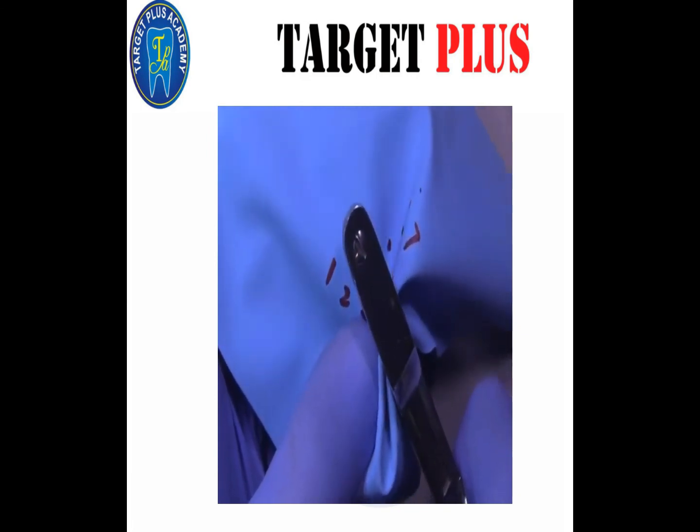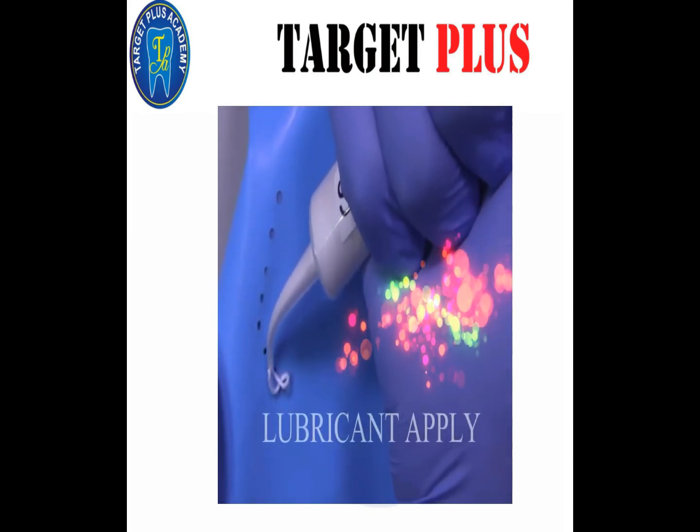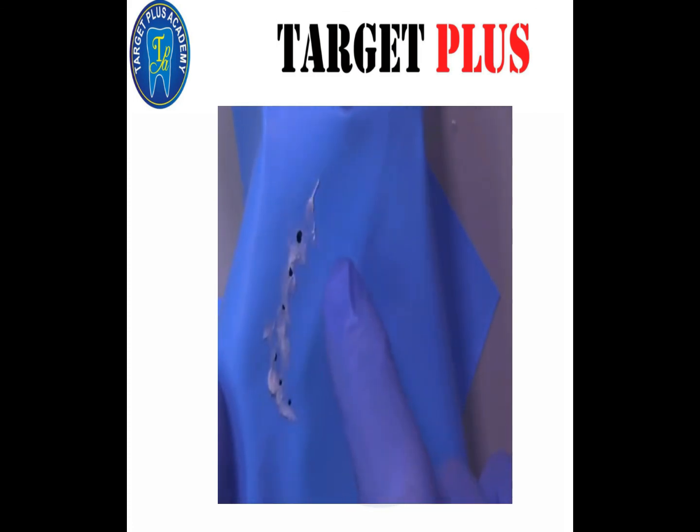Third step is lubricating the rubber dam. Lubricate both sides of the rubber dam, which facilitates passing the rubber dam through the tight contacts.